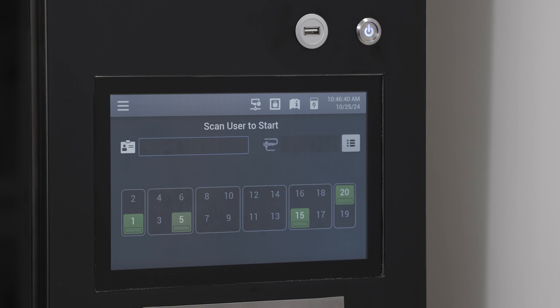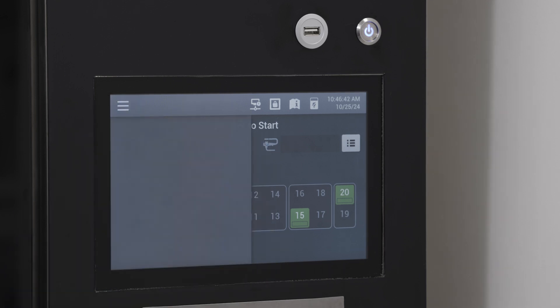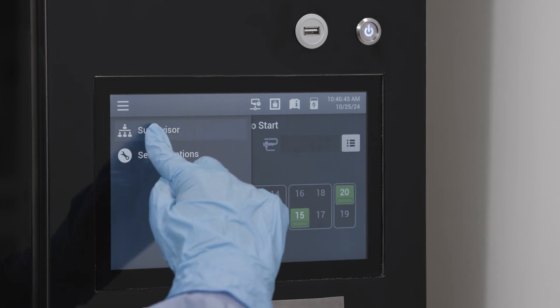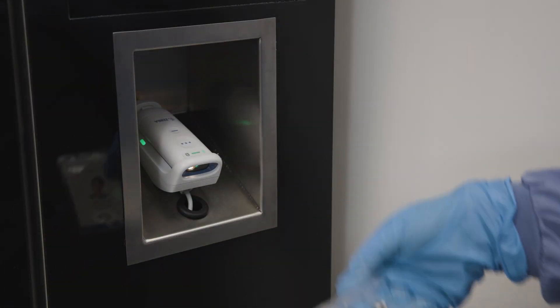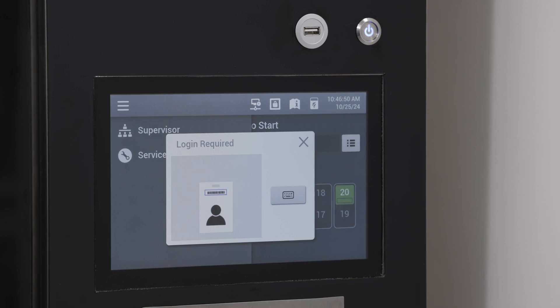Supervisor mode can be accessed via the toggle menu located in the upper left corner of the display, or via the main screen using either barcode scanning or manual entry. Depress the menu button from the navigation bar and select supervisor. Enter the user ID via the barcode scanner or manual entry using the virtual keyboard.